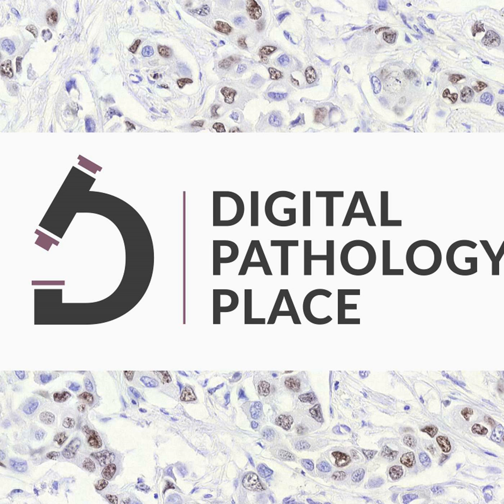So that brings us back to the gold standard, what we compare to, and I would love to hear your thoughts on that. I have to be careful about what I say, no claims over here, and this was not from me. I heard it at a talk and forgot who mentioned it. We are comparing multiplex immunofluorescence to immunohistochemistry as the gold standard. But is that the right way? Do we want to look at patient outcomes?